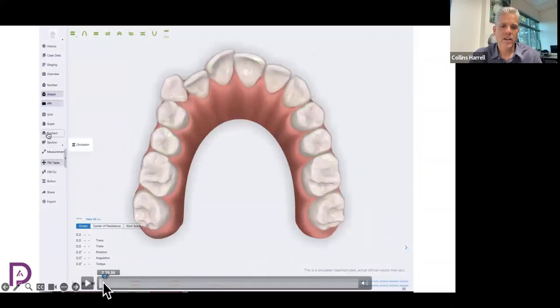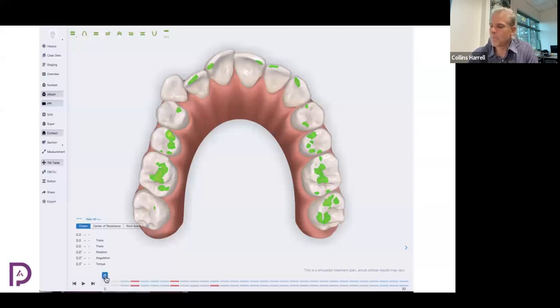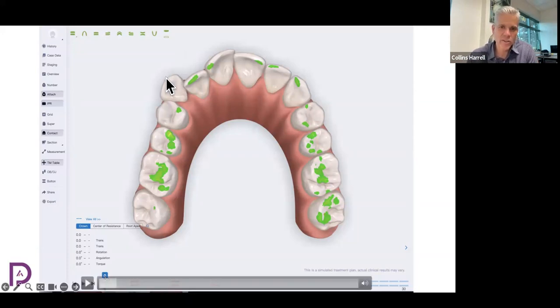So is this a real open bite case? Well, there's not really any overbite, but you can see in the starting position that the patient actually has pretty well distributed contacts, pretty balanced occlusion. And every anterior tooth does have an occlusal contact. It's not very big and it's on incisal edges, but it's there. Okay, so she doesn't have a tongue thrust habit or a thumb sucking habit or something that's keeping her teeth from having contacts. Obviously, the canine that's blocked out doesn't have any occlusion because it's completely blocked out, but everything else is in occlusion.